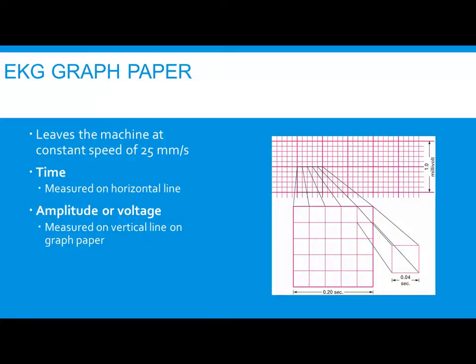And then 1, 2, 3, 4, 5 to the left. Alright, and then just make you a box. Circle that box. So you should have 5 small boxes going up and 5 small boxes going to the right. Just make you a square, just like that.